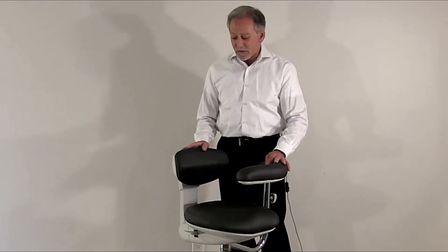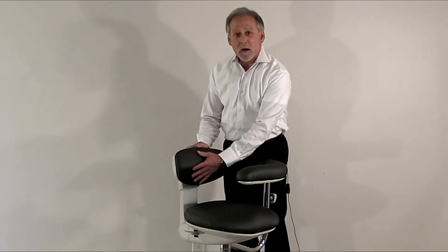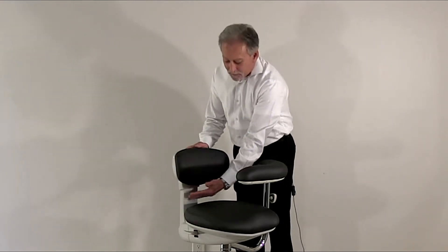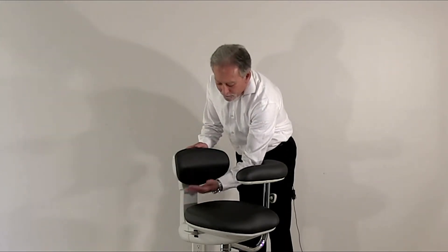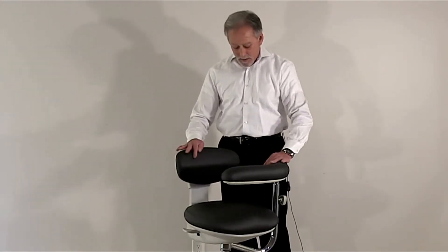The backrest itself is shaped in a lumbar style to actually hug the lumbar area of the lower back and allow space underneath for the hips to protrude, so that the backrest can get fully in on the lumbar area.